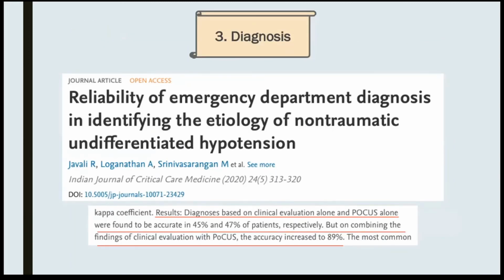What else do we use ultrasound for? So we've just discussed fluid status. Unfortunately, fluid status is not a great marker. Then we discuss, are we going to use the ultrasound to see if the fluid worked, or whether I should give fluid? And there's again very big controversy and probably not good enough evidence to support it.